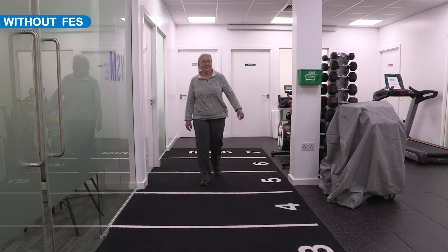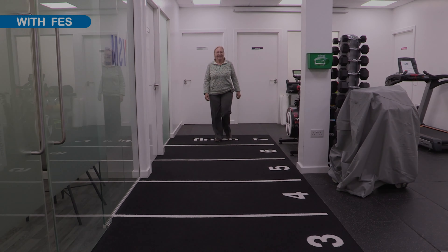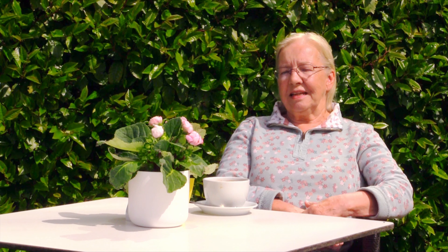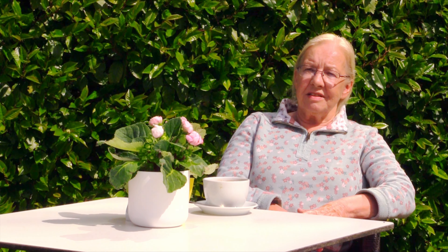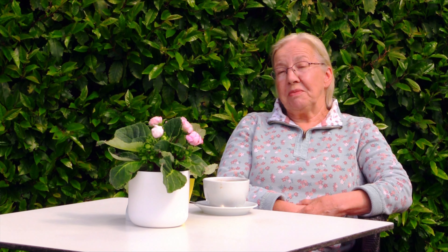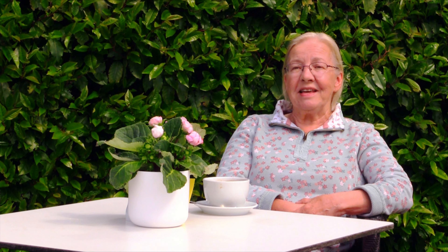There has been some good support to make sure I get the best out of it. It worked very well and immediately started to improve the way I walked. The easiest thing to do is when I first get up in the morning, the first thing I put on is the gel pads and the wires, because they're out of the way. I put it on about three or four days a week when I might go for a walk. There's a pressure switch in the shoe, and I attach the wires to a little box around my waist, set it to the right intensity, and that's it until I go to bed.